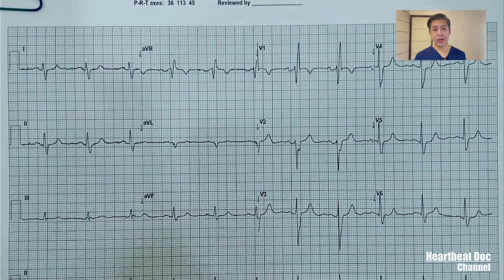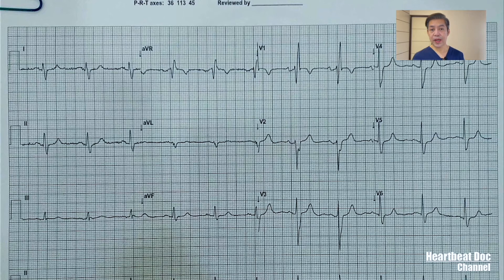Now let's go back to the ECG tracing I showed you and examine the computer's ECG interpretation. The computer read it as sinus rhythm. We examined lead 2 — it is upright in that lead, also upright in leads 1, AVL, V4, V5, and V6, and biphasic in lead V1. All of them support that this is, in fact, a sinus rhythm.